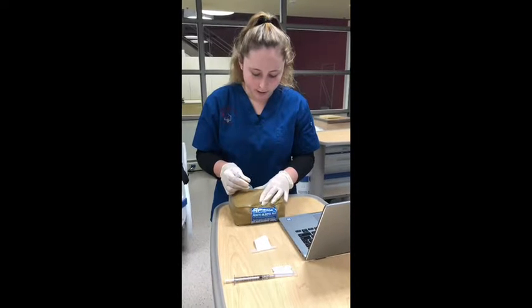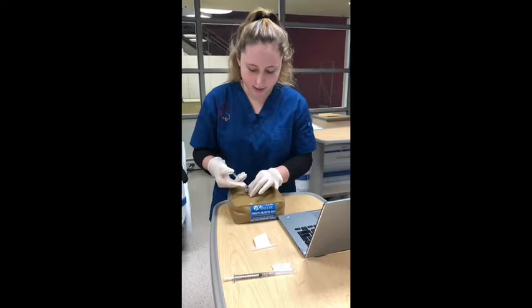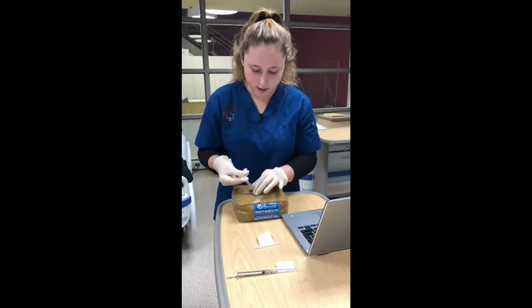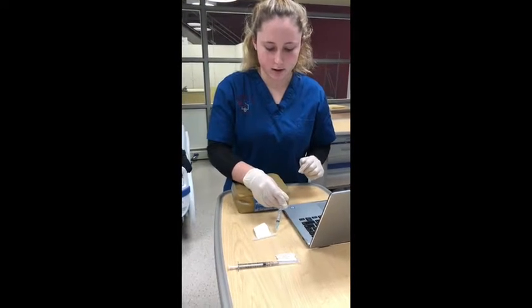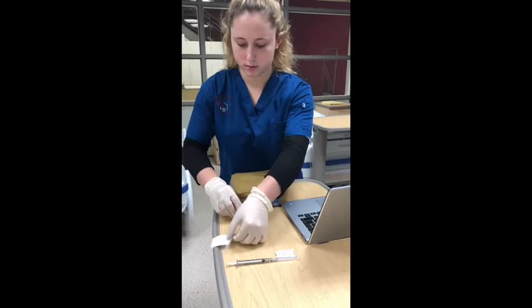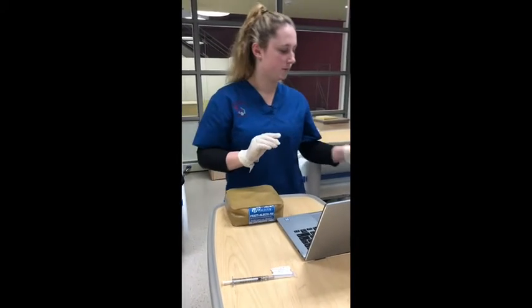And then I just wanna let go and stabilize my needle, and then I can inject. And then I will remove it. And I wanna make sure that I am recapping my needle for safety. And I would be disposing of it in the sharps bin.